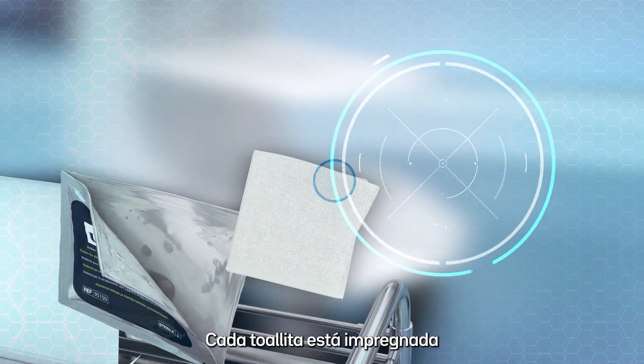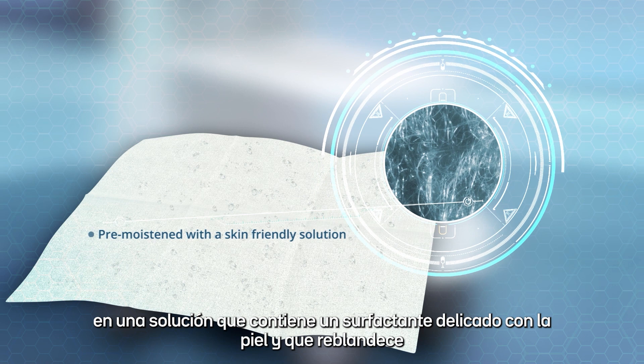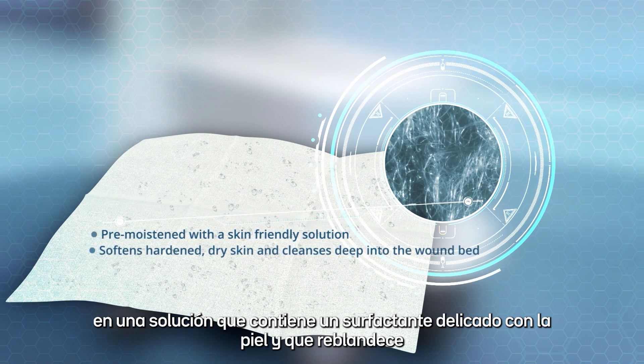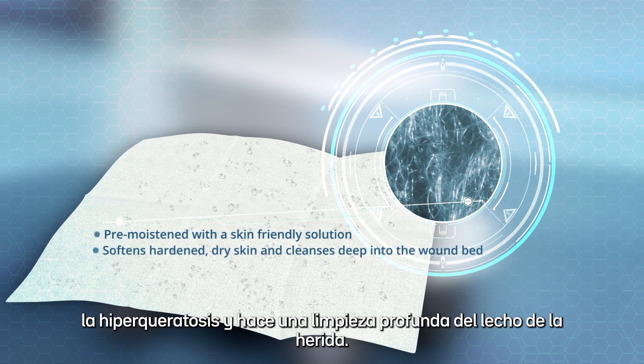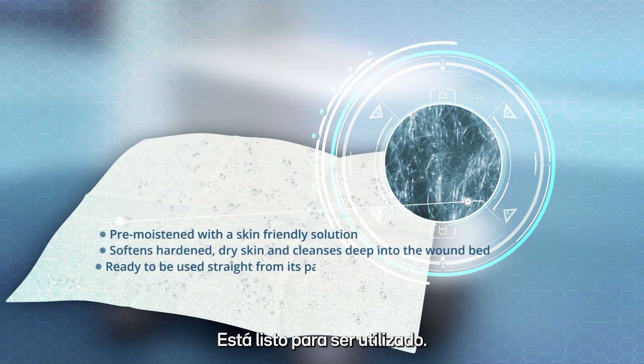Each cloth is pre-moistened with a solution that contains a skin-friendly surfactant that softens hard and dry skin and cleanses deep into the wound bed. It is ready to be used straight from its pack.